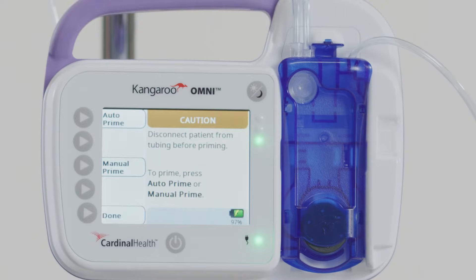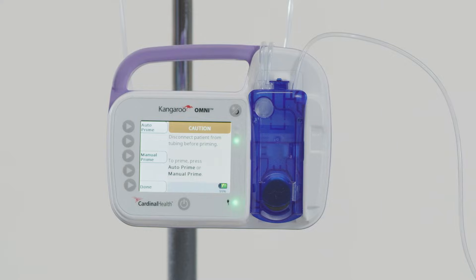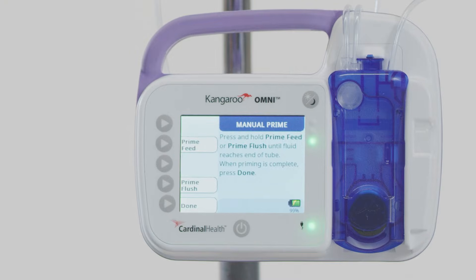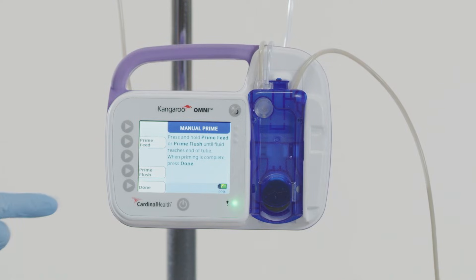If desired, manual priming is another option. Fill the bag with formula or connect to a pre-filled container, noting that a patient must not be connected to the pump when priming occurs. Press Manual Prime. If you are using a feed and flush set, you can also manually prime the flush set by pressing and holding the Prime Flush button until the water reaches the end of the tubing. Then press and hold the Prime Feed button until the enteral fluid reaches the end of the feeding set. Press Done when complete.